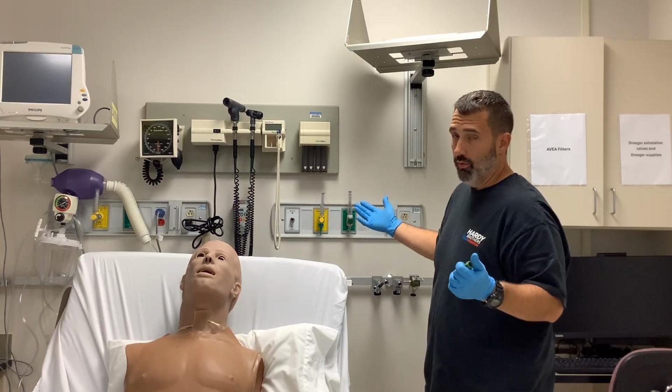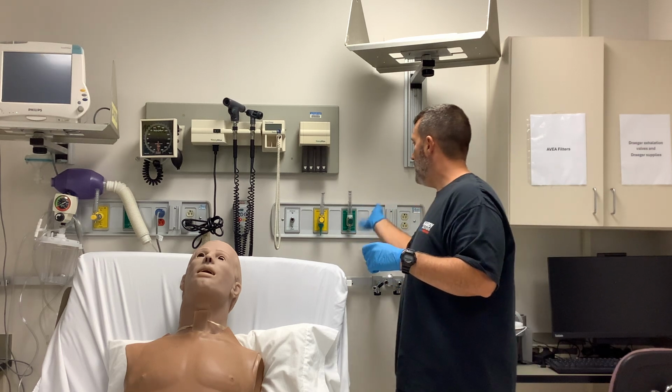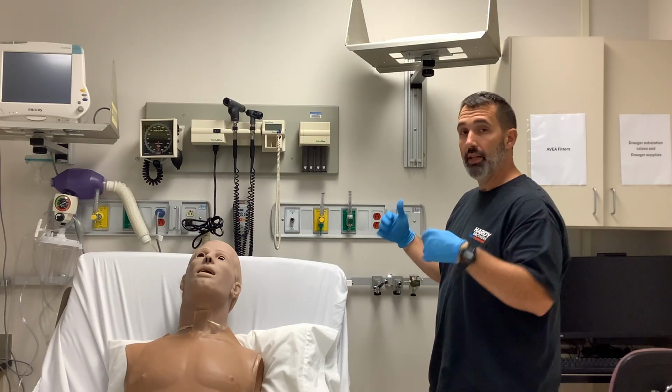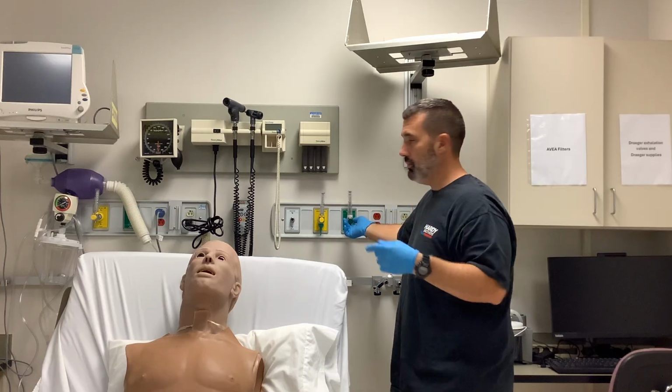And our working pressure for respiratory therapy equipment is 50 psi. These two flow meters are calibrated at 15 liters per minute. Can they deliver more flow than 15 liters per minute? Sure. Let me just listen.